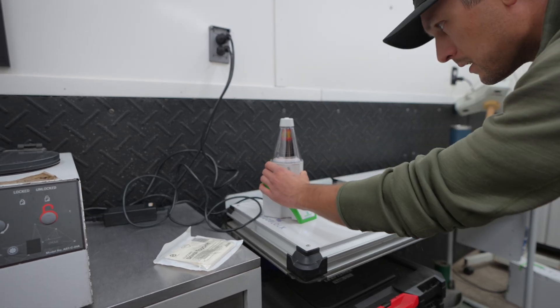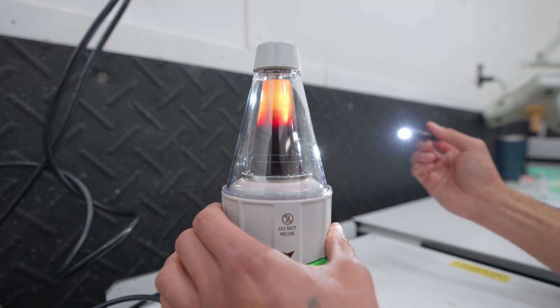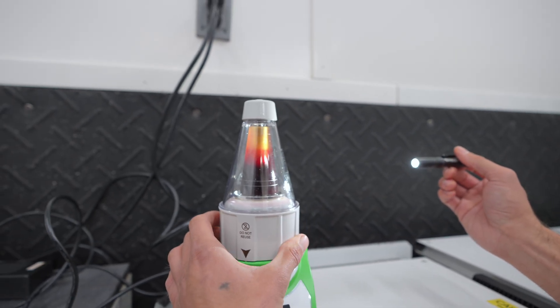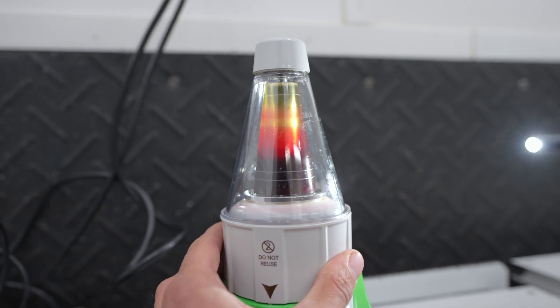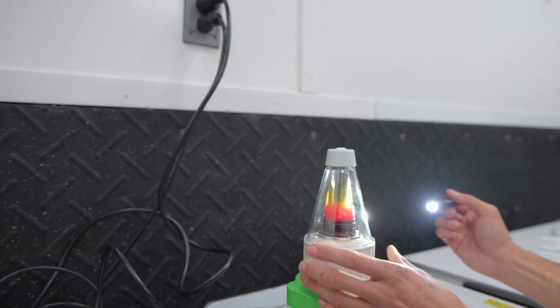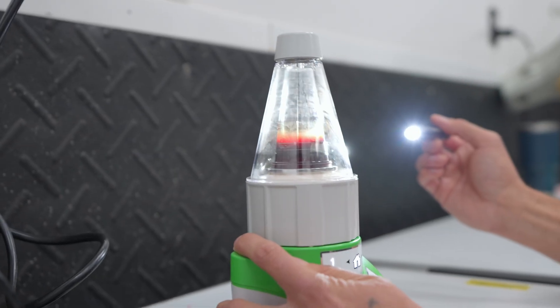After that spin, we actually separate the cells from the rest of the blood product. We watch that line of red cells as it goes down, and once it's between these two lines, we know we've got it in the right spot. Then we switch it to position two, and that spins off the rest of it, leaving us just with that platelet-rich portion.